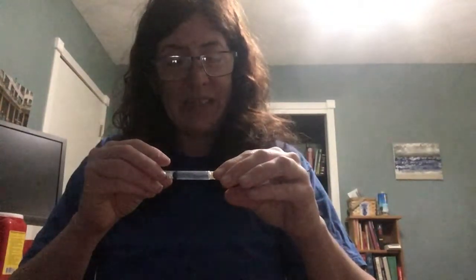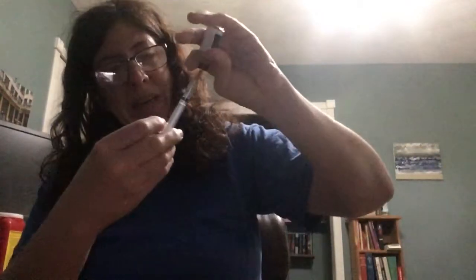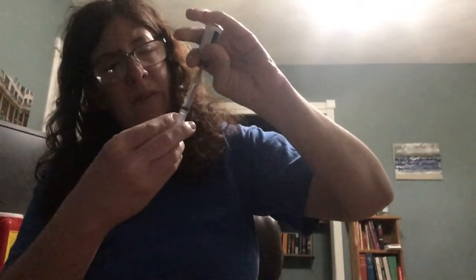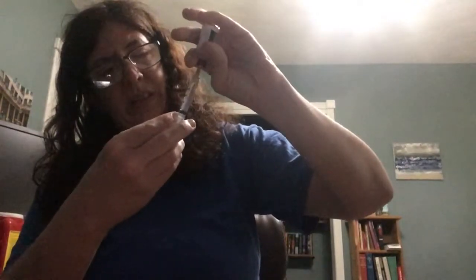Yes, I could just switch the cartridge over, but I like to keep my supplies on the same schedule. So, usually I put 2.5 milliliters in. Again, I typically only go through maybe 1.5, but you never know when you might be eating an extra carby meal or have harder to control blood sugars. And there we go. So I'll pull that back to where it was when I inserted it. Gonna flick the needle a bit and push up. Make sure all the air is out.